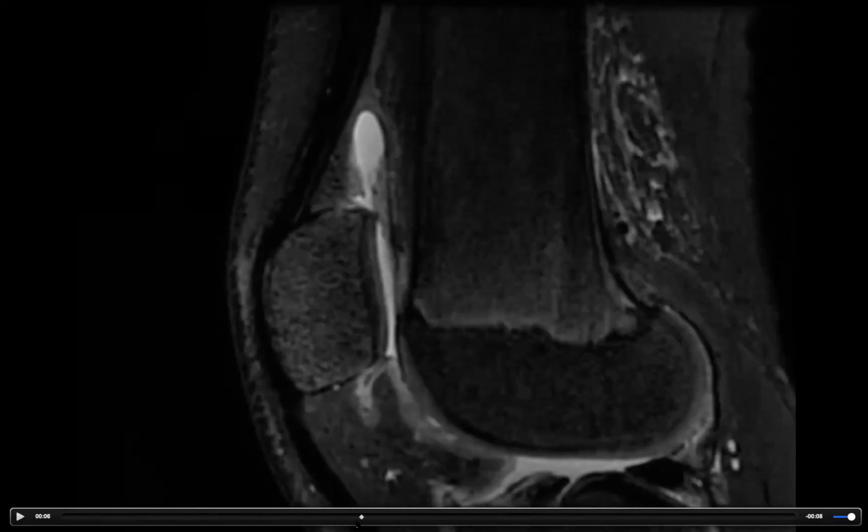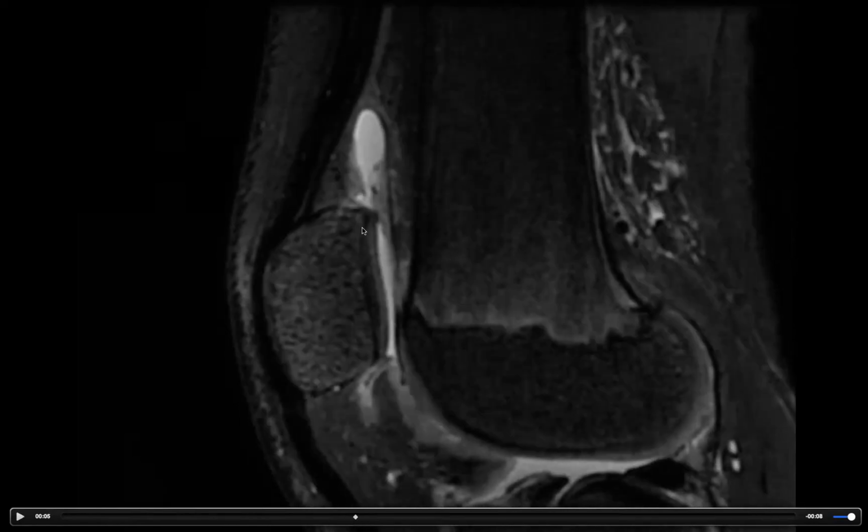In this case, I'm sorry, it's pretty zoomed up, but this is your kneecap right here. And so this is the front of the knee. The back of the knee is on the right side of the image. And then you're seeing cartilage that surrounds the bone. This is fat suppressed, so you see the fat is all dark in the bone. This is a kid, so kids have these growth plates in their bones. There's cartilage within the bone and new bone forms from this cartilage. So that's how somebody grows taller.